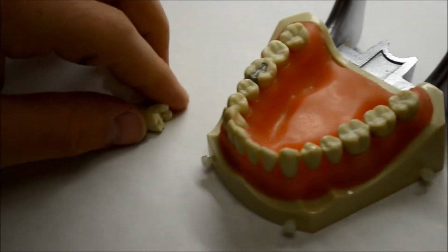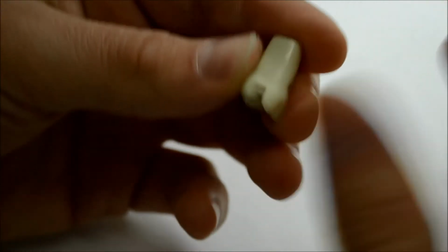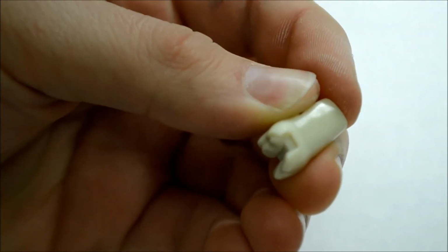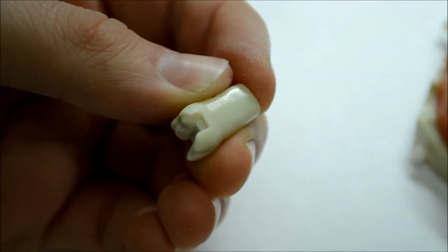A good way to practice, apart from drilling on the wisdom teeth, is to drill on used teeth. So for example, your waxing teeth or used teeth from your upperclassmates, and to just drill on the side of them. You can draw a shape and try to follow it. You can try to just make a straight line, and that way you practice your control skills.